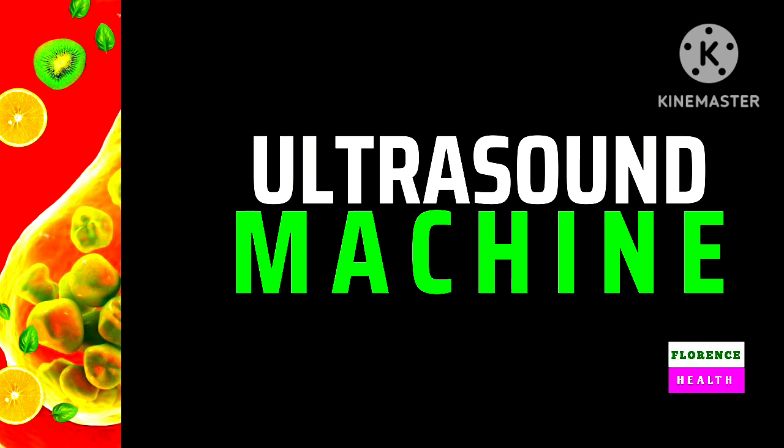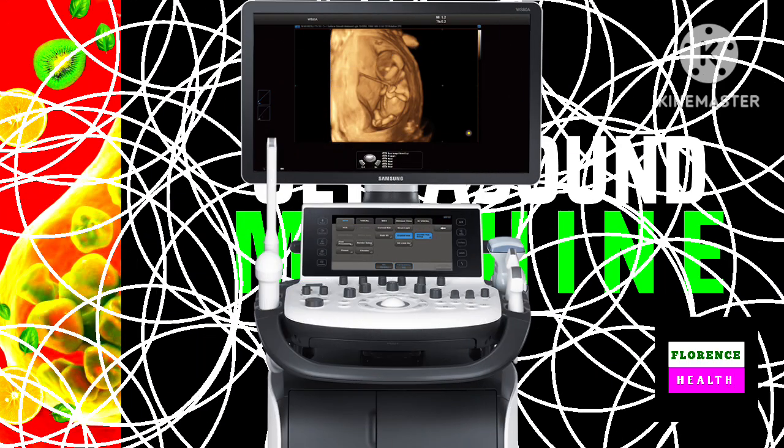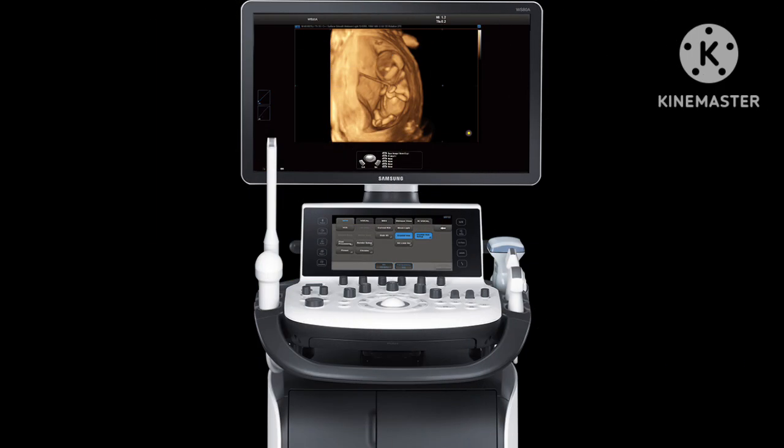The position of each knob is not specific. That means the position of each knob is different in different company ultrasound machines. You should know where your knob is present in your ultrasound machine. As a beginner, you should use within 10 lakhs ultrasound machine. The higher the cost of the ultrasound machine, the higher the number of knobs.